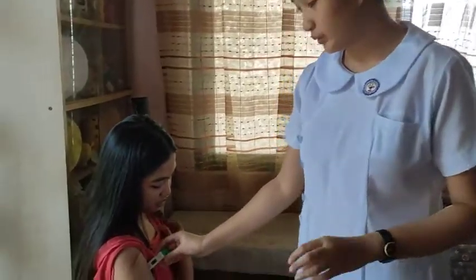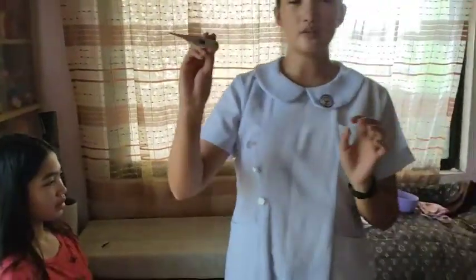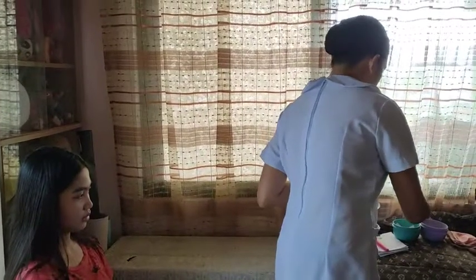After that, we remove the thermometer and read the temperature findings. We have 36.2 degrees Celsius. After that, we turn off the thermometer and proceed to disinfecting it — again using cotton balls with alcohol, this time vice versa, starting from where we hold it to the tip that came in contact with the client.